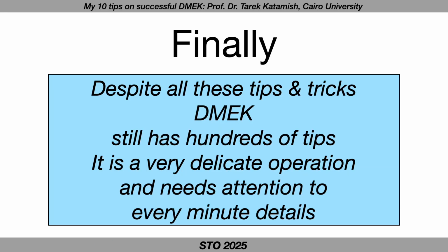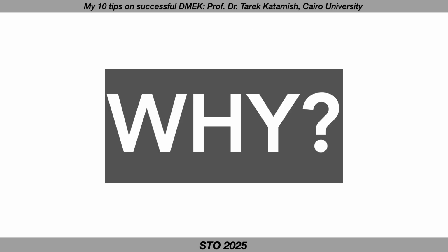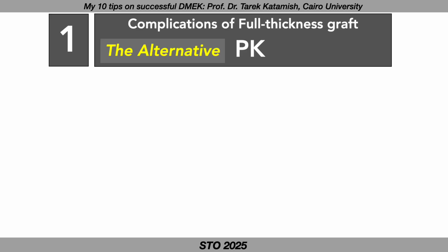Finally, as you see, despite all these tips and tricks, DMEK still has hundreds of tips. It is a very delicate operation and needs attention to every minute detail. The last question is why? Why am I doing this delicate and difficult operation with a tough learning curve? The answer has two folds.